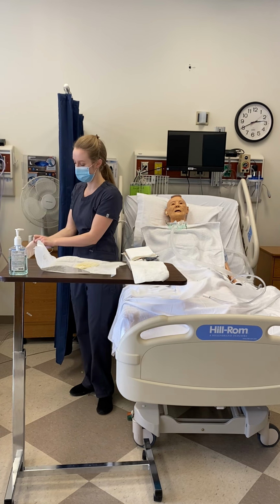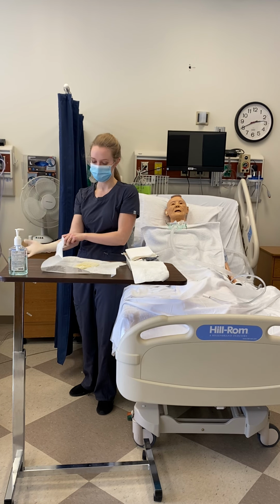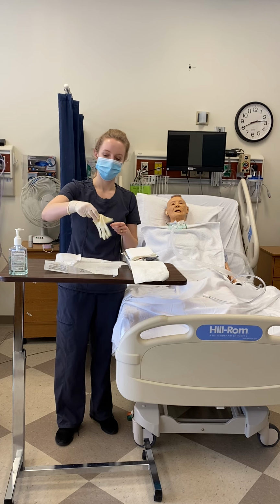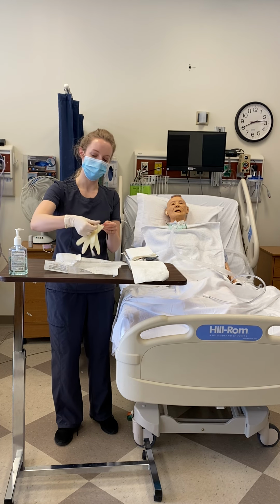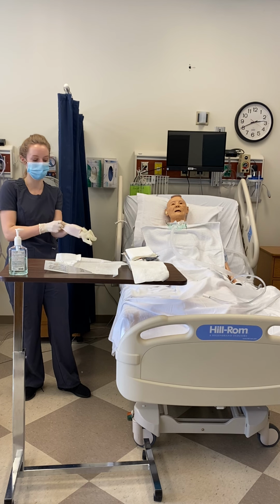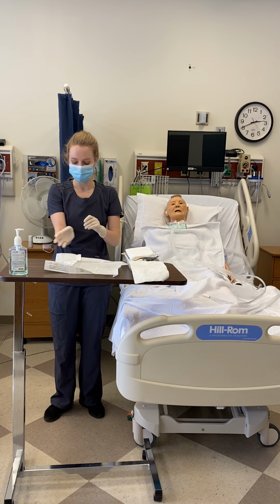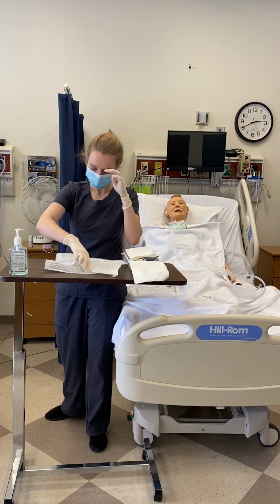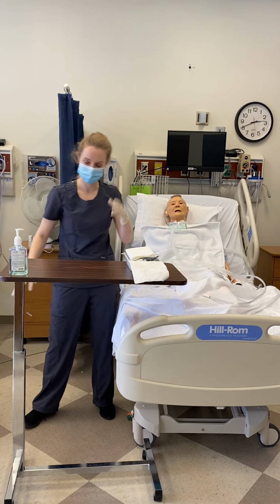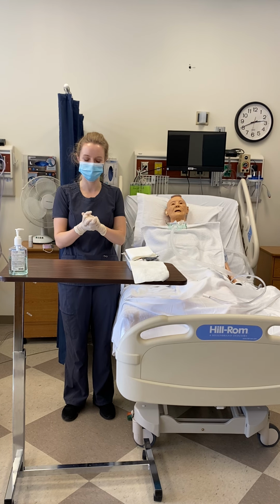Picking up, donning my dominant hand, and then my non-dominant hand, making sure that my cuffs don't roll and I don't touch anything. If I did, normally I would start over, get a new pair of gloves, not touch my face or put my hands below my waist like I just did.